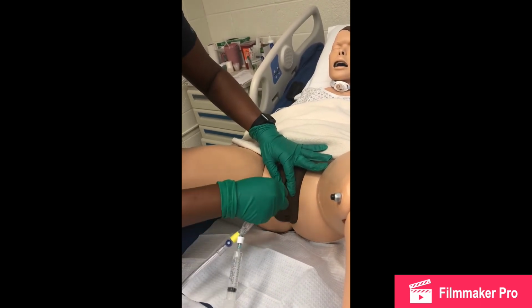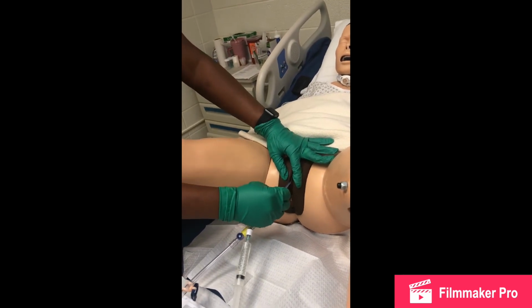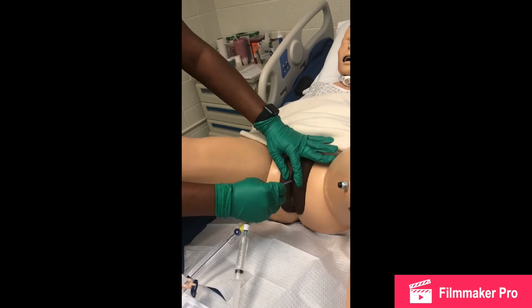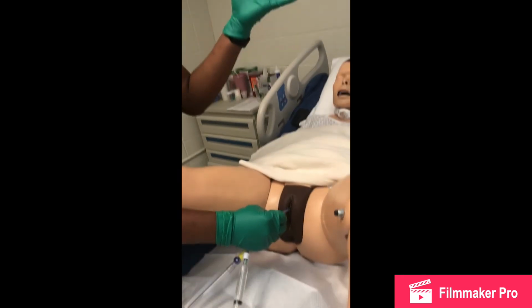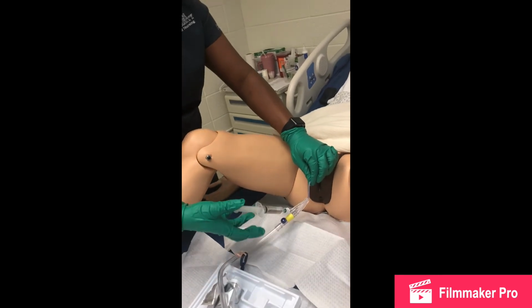I'm careful so I don't break sterility. Right now that I've met resistance, I can now use my hand that's not sterile and hold right here while I insert my fluid to inflate my balloon.